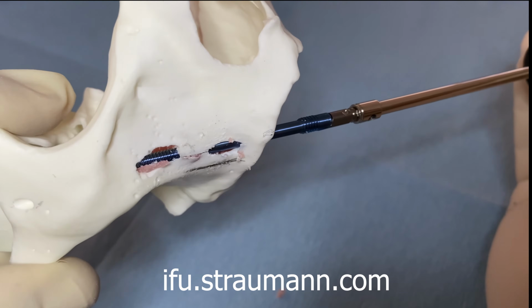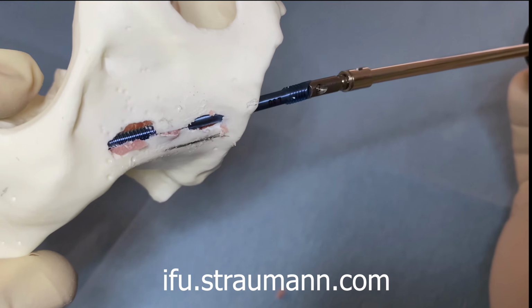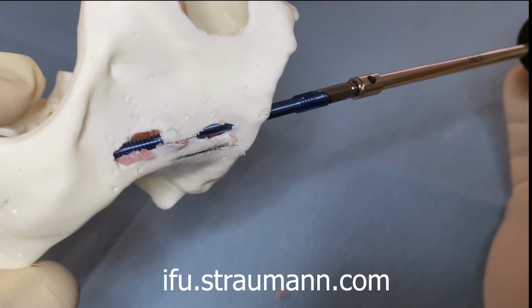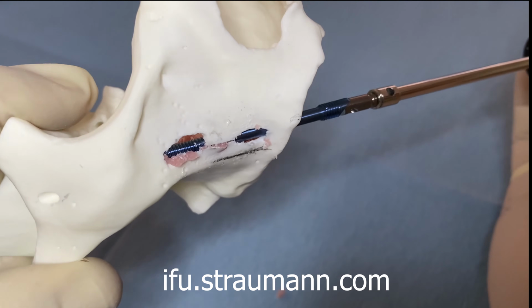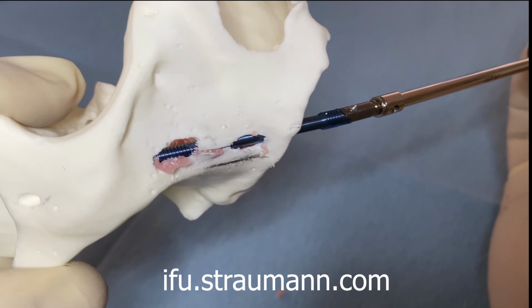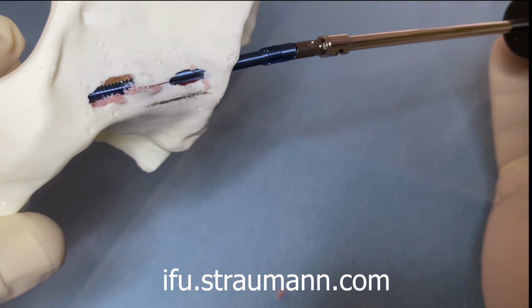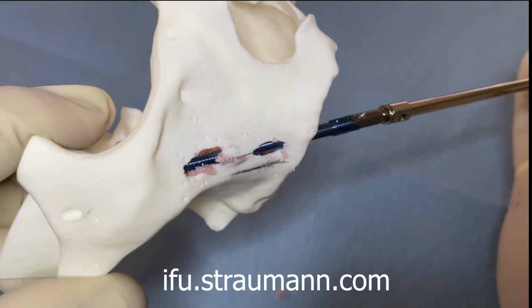So I can put pressure on the shaft of my driver, and as you can see, the implant is parallel to the back of the sinus osteotomy, and I'm still keeping a significant control on the direction of the implant because it has not engaged the zygoma bone yet.